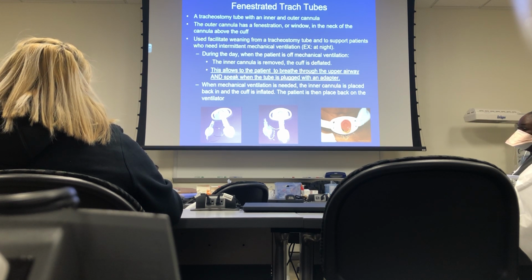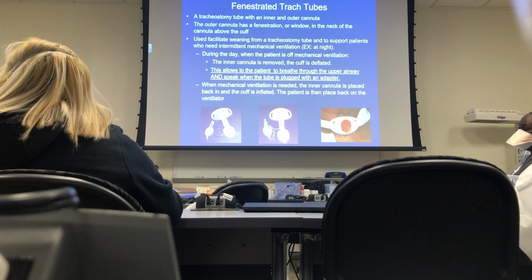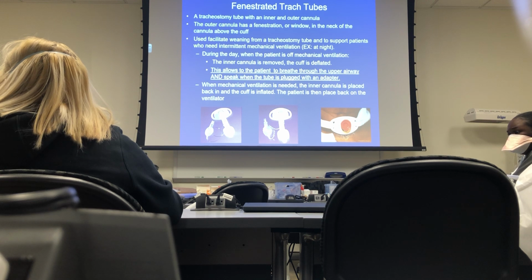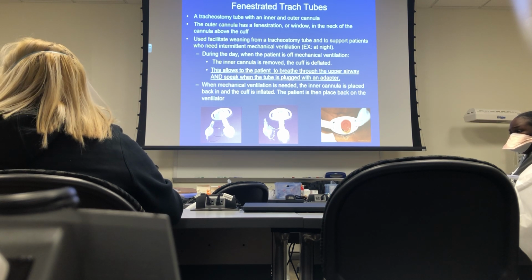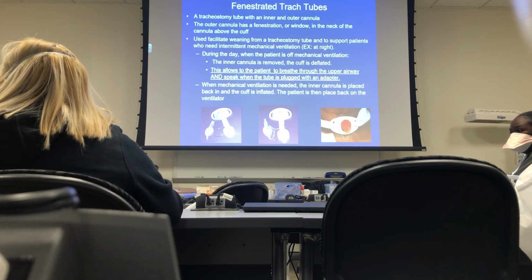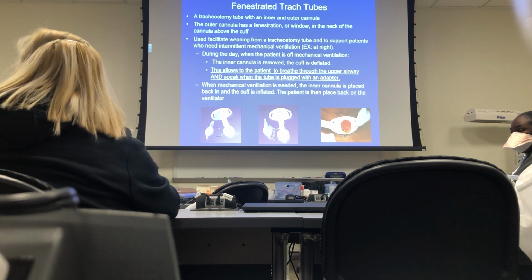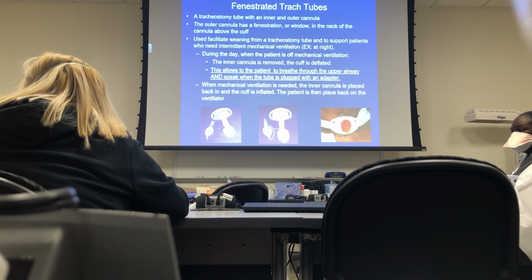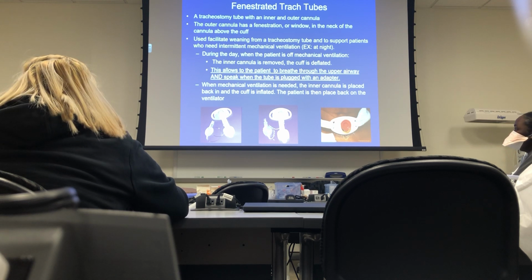Can they talk when the button's on? You'll see people hold their finger over their trach if the cuff is down, because one of the first things you want to do in the hospital when somebody's weaning off mechanical ventilation and during the day they're off, the doctors will say, let's drop the cuff. Okay, see if they tolerate that. If your patient starts coughing and a lot of secretions are coming up that look clear and white, their swallow mechanism's been impacted by being trached. They can't swallow, so they're aspirating their saliva constantly, all right?